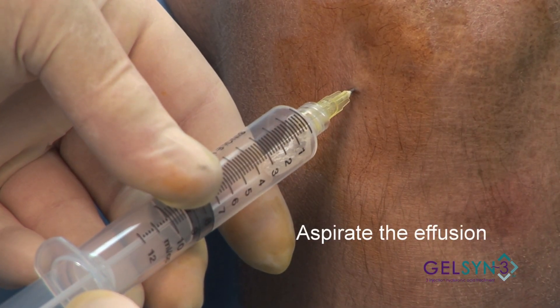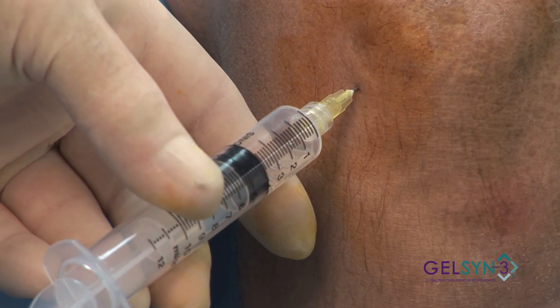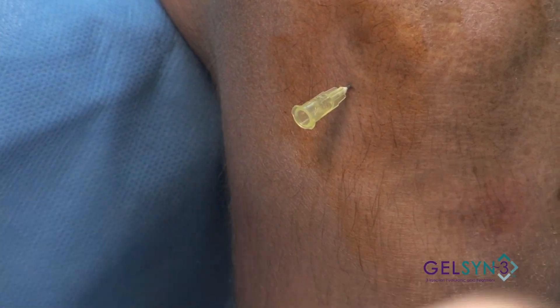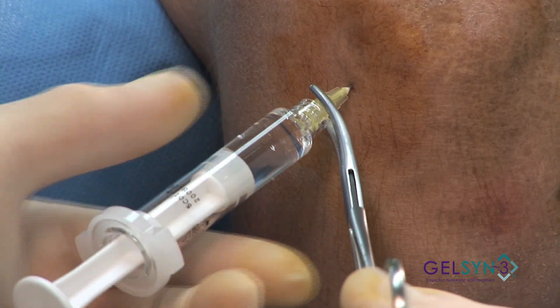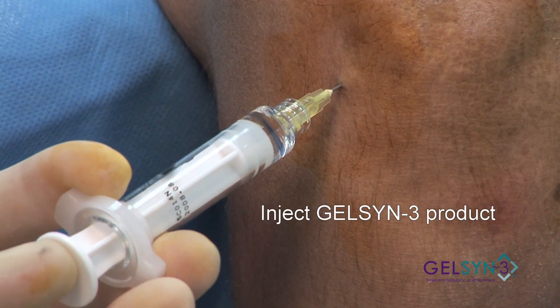Aspirate. And we know we're in the joint because we can see the fluid. Stabilize the needle. Apply our syringe and inject.